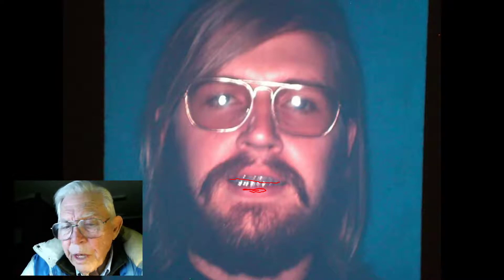This is not a great picture, but his bite is open — he can't actually bite his front teeth together. When we left six months before, you couldn't see his lower teeth where his upper teeth came down over them. We had an intruding arch wire on the lower and on the upper separating the teeth. He has a beautiful class one relationship, but with the deep bite, these lower anterior teeth are crowded.